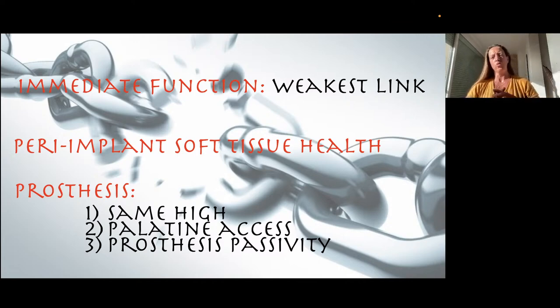Also, by the time that we place our abutment, everything will be done at the abutment level. Immediately we are protecting our soft tissue health, our peri-implant soft tissue health. And this is crucial because it is between the soft tissue and the abutment that we will have the biggest biological sealing. And for me, I think that the multi-units are one of the biggest secrets of the All-on-4.